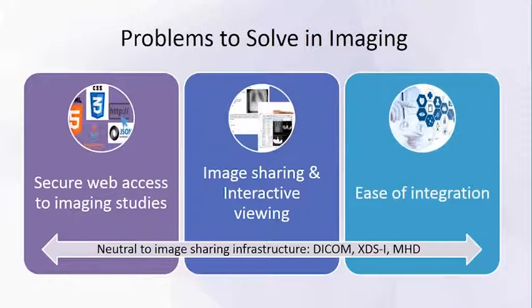So we also want a common integrated access, just like many other information. Using web technologies is a good way to do that, so that applications can integrate not only other clinical information but also images as part of that whole ecosystem.